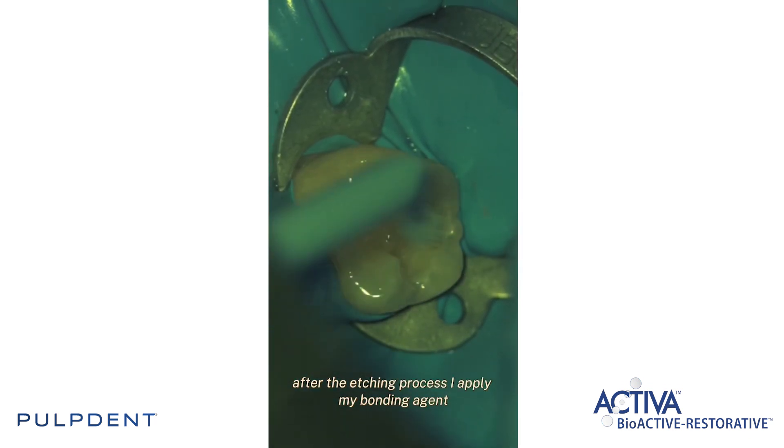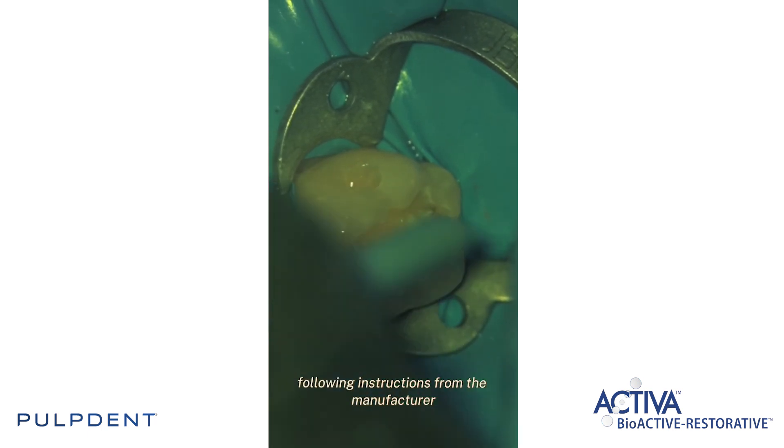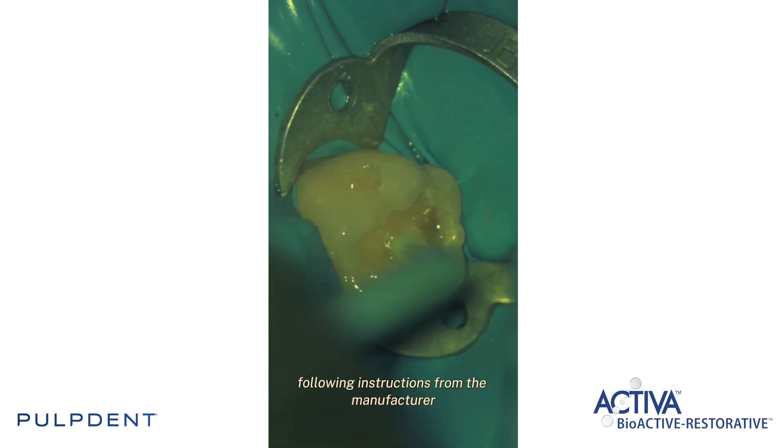After the etching process I apply my bonding agent following the instructions from the manufacturer.